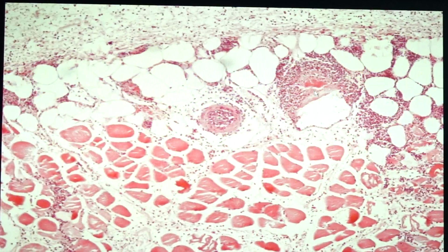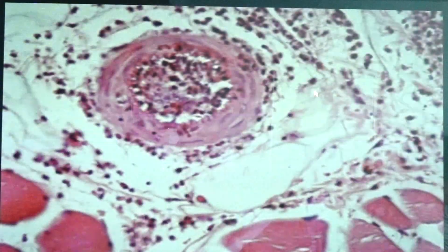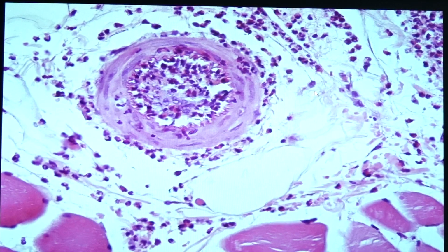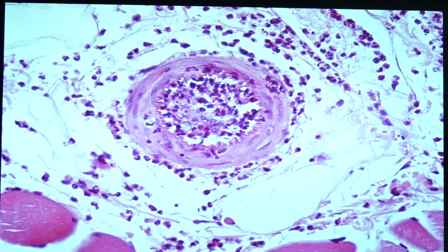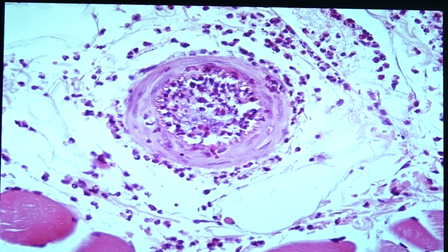Although in this case, this is only showing the presence of perivasculitis. Okay, so this is a well-formed arteriole, surrounded by segmenters. So in the biopsy, usually we call this one perivasculitis. And then you would see the presence of intraluminal inflammatory cells. Okay, so this is slide 16. Next, we go to slide 211.